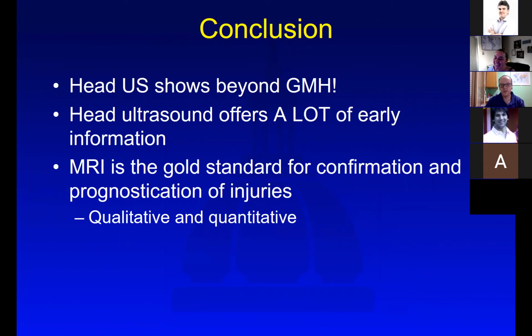As the audience is pointing in the chat, so amazing collection of cases, and as you focus on the correlation between ultrasound and MRI, which I think is something very rich, and at least here in Brazil, and I believe in many practices, it's not that easy to have this matching between an early ultrasound and a follow-up MRI. Sometimes it's not that easy, but amazing cases. Thank you for your presentation.